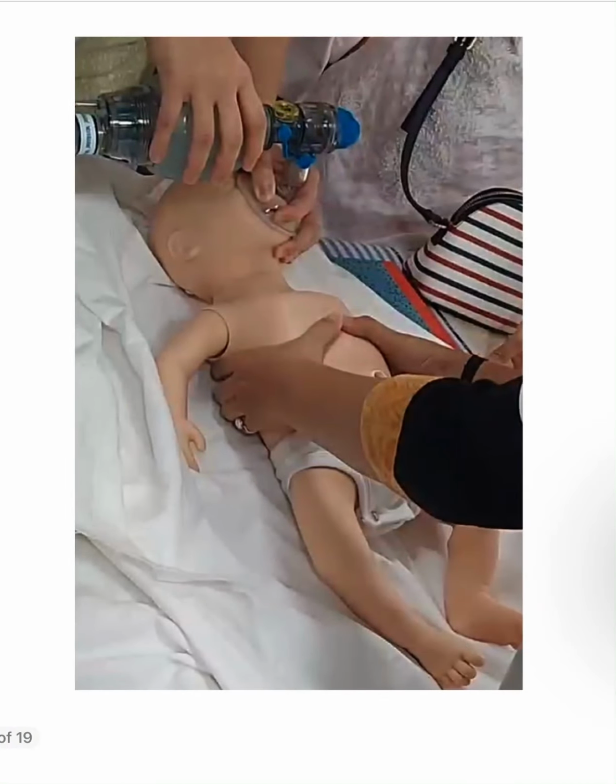Okay. See, this is a picture. So basically what is this, guys? This is the ambu bag, guys. Okay, and how do you hold the ambu bag, guys? There is a technique known as the C technique, and it is known as the E technique. So basically with the C technique you hold the mask on the face, and with the E technique you lift the chin up, guys. Okay, and I said about the two techniques, guys.